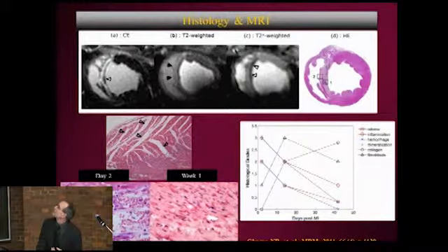Similarly, we can look in regions of elevated T2. Remember, that's our indication of water. And you can see that in those tissue regions, you get a lot of fluid in the interstitial spaces, reflecting the edematous response. And finally, in regions where there might be significant signal loss associated with the T2 star decay, those dark regions, those are regions where indeed there is hemorrhage, where you can see red blood cells accumulating in the tissue and later on iron deposits associated with the cleanup of that.